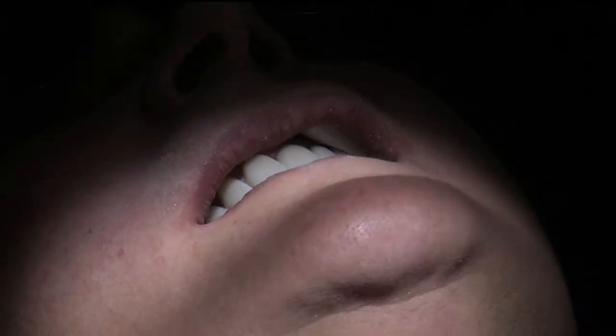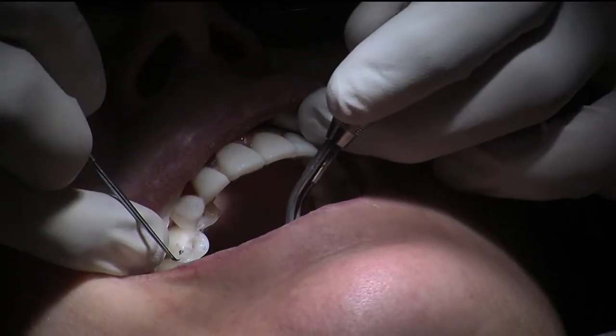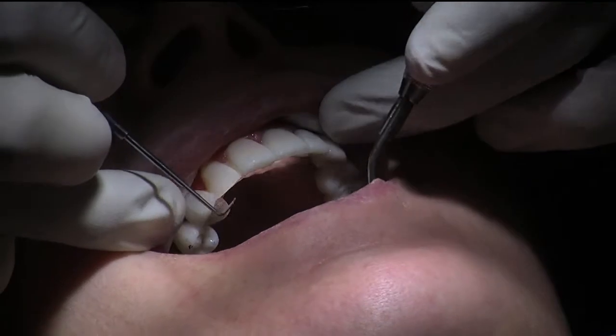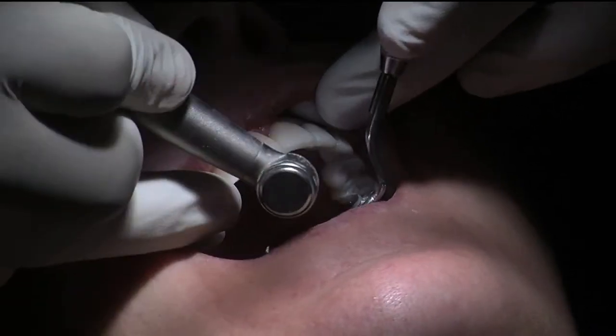What this does is it makes a mark. Open. There's a blue mark, and then a tiny red mark in the middle. It's the red mark — which is a bullseye — that I go for. So it's very clear to me now where to make the minor adjustments.